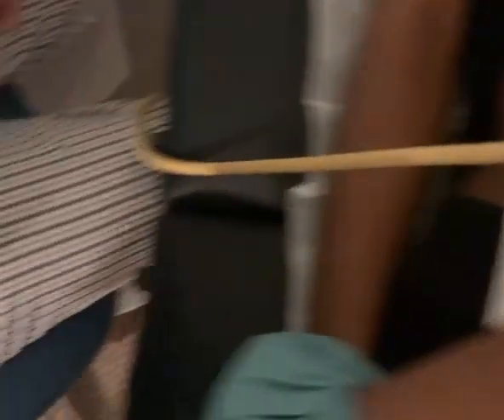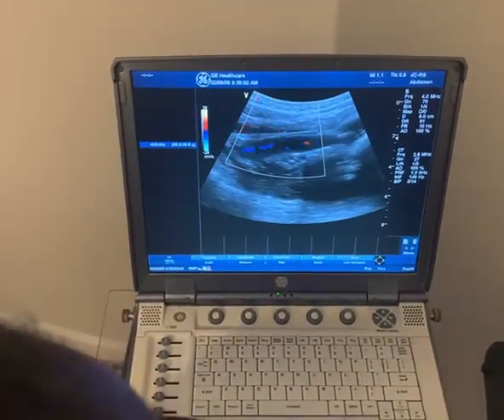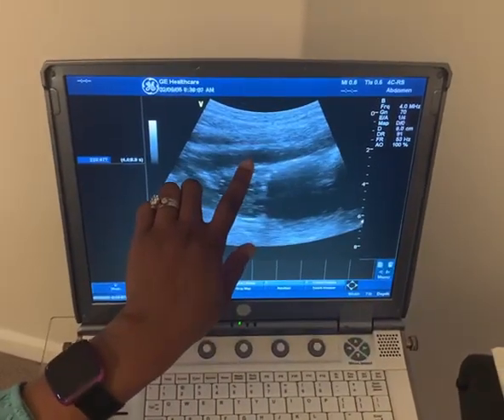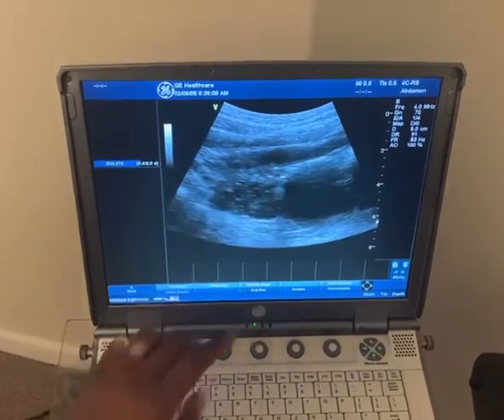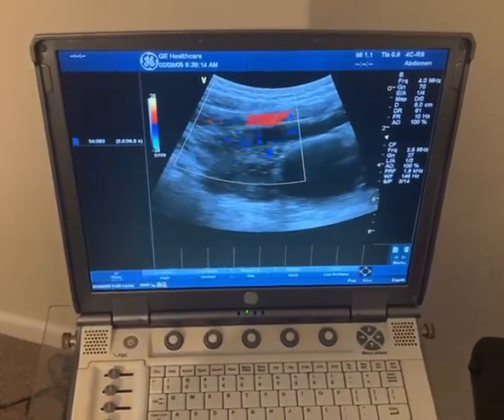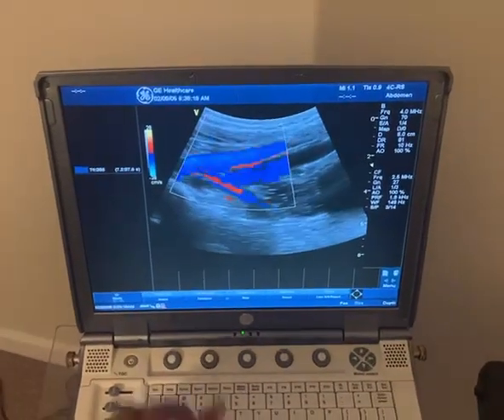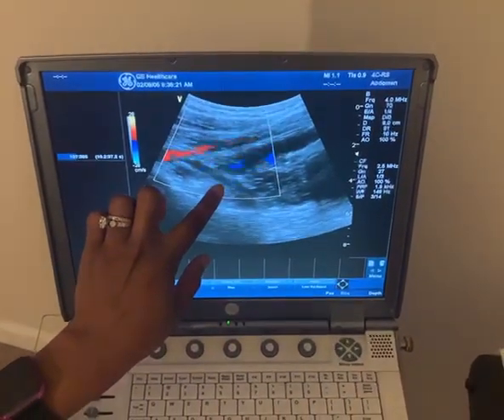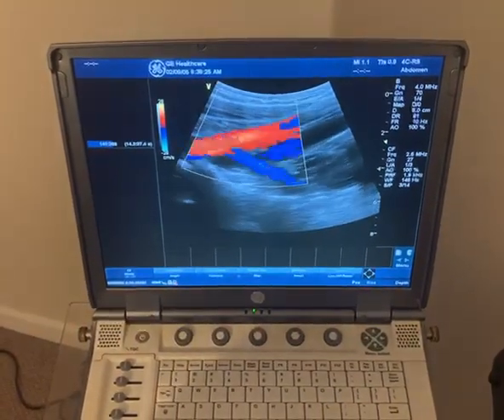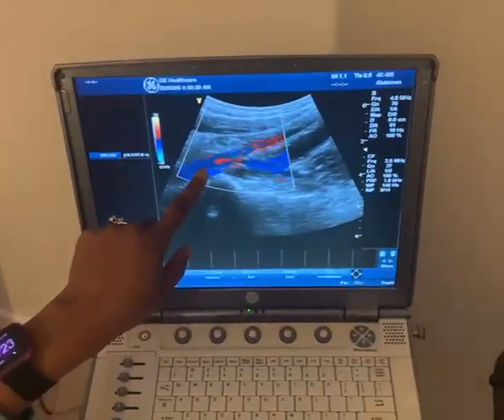Going back to the screen, I have my color box currently on. I'll take that off for a second — in black and white at the groin I can see my external iliac vein and my external iliac artery. Putting color on, you can see again your vein and your artery. As I rock the probe up, you're going to see the internal iliac artery, also known as the hypogastric artery. Rocking the probe further up toward the belly button, I can see the common iliac artery.